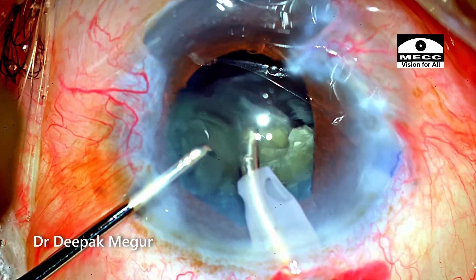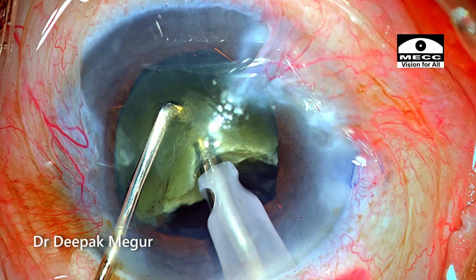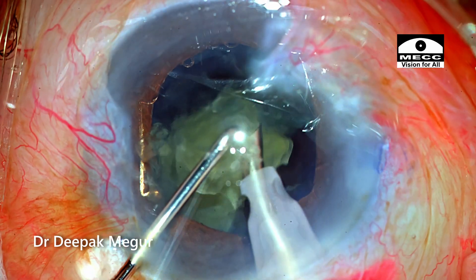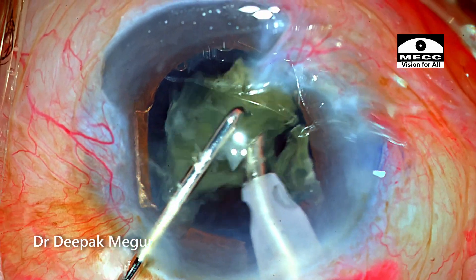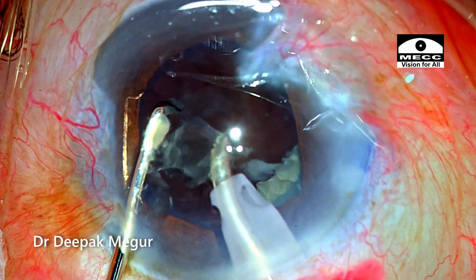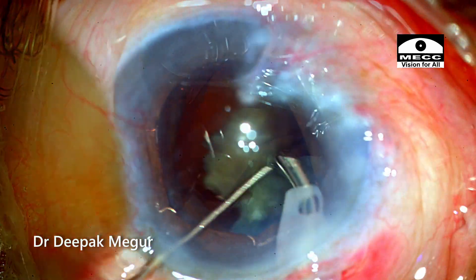Half of the nucleus is emulsified. Time to replenish the OVD. The remaining heminucleus is dealt with similarly. The iris is still behaving well, which is a good sign. The last piece is hidden somewhere under the iris, manipulated out into the visual axis, and then emulsified.